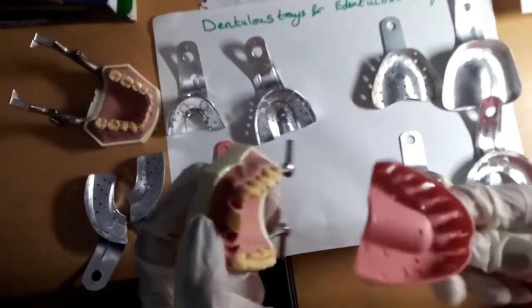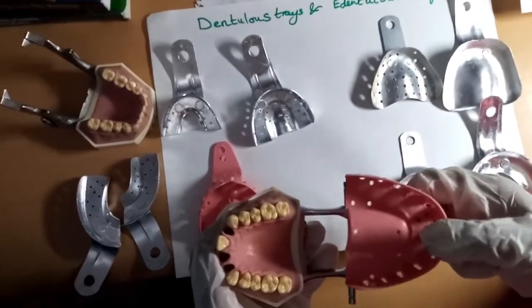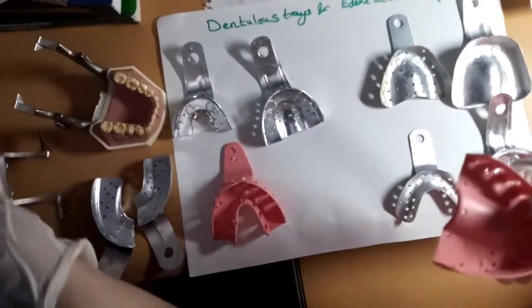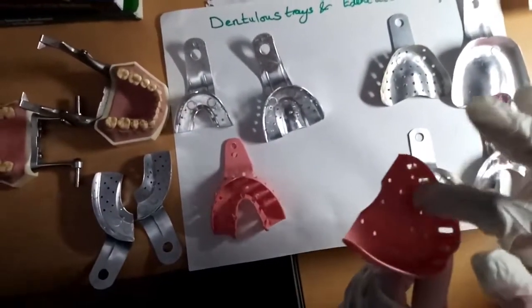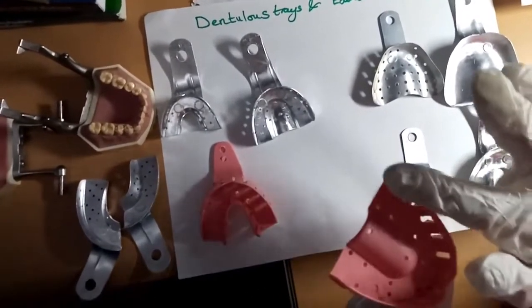Then we have the body, okay? This is the body of the impression tray. It has the floor area and the flange area. So this is the flange area, okay? And this is the body, the floor, this is the floor area and this is the flange area.